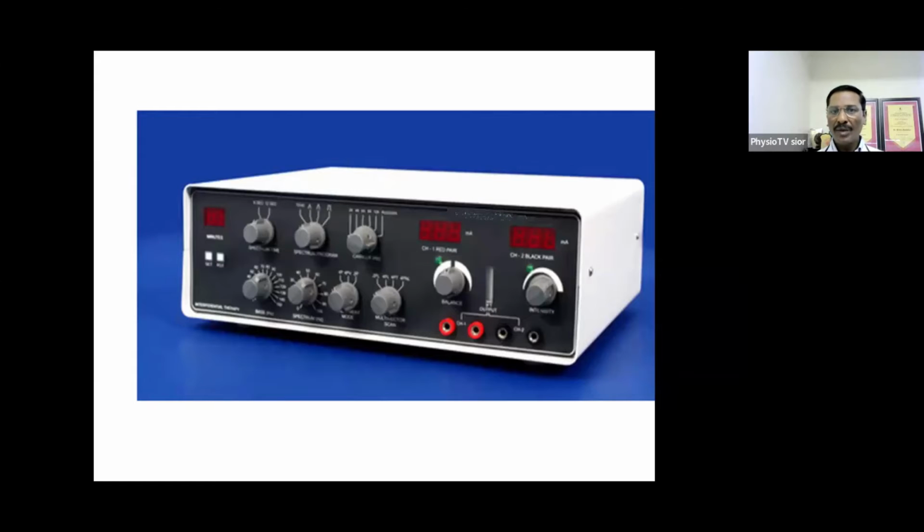Then we have different waveforms. And on the lower or bottom side, we have the base button. You can see the base button, the sweep. Then we have the different modes, that is 2-pole, 4-pole, and 4-pole vector. And then we have a balance knob to balance between the right and left channel. And then we have the intensity knob. There are two display units, the display unit for channel 1 and the display unit for channel 2. And then we have the sockets for connecting the 4 electrodes, 2 for the red channel, 2 for the black channel.